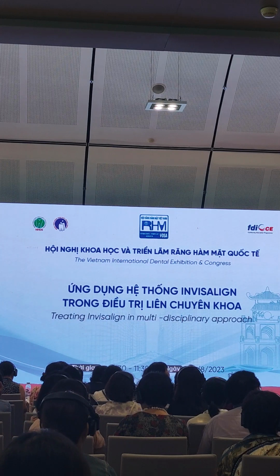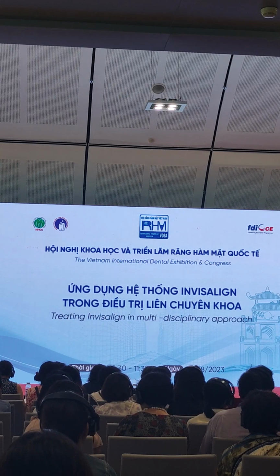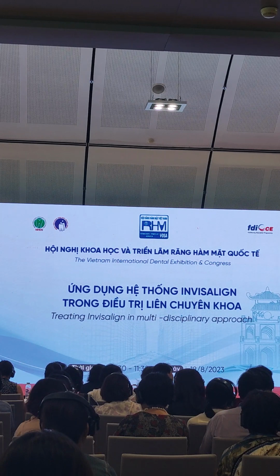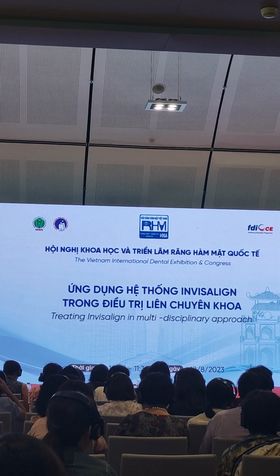One last question for you. After the orthodontic treatment by Invisalign, there might be some premature contact or interference. Do you do the adjustment right away, or do you wait for a while to see how the occlusion will settle?